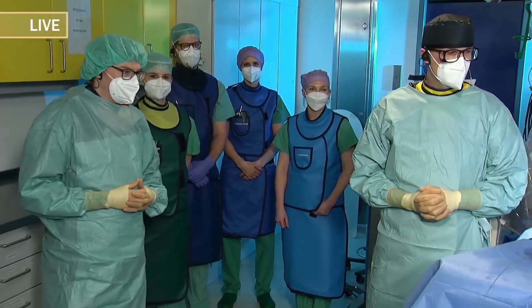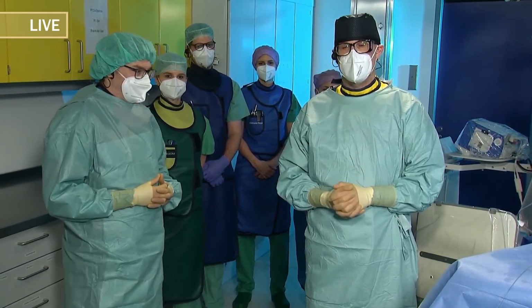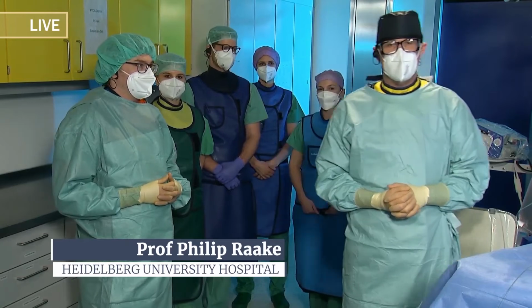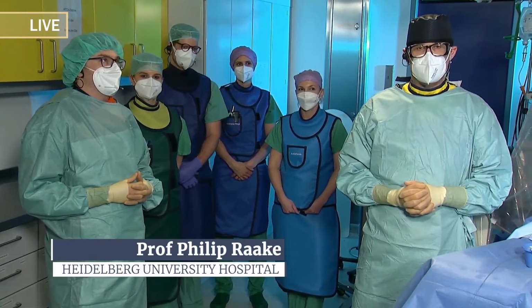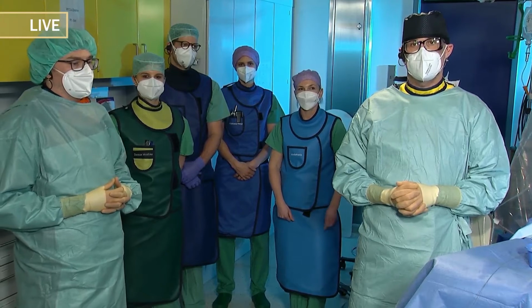Hello, welcome to Heidelberg. Welcome to the University Hospital Heidelberg, to the hybrid OR in our cath lab. We have a live case today for you. It's a PASCAL Ace implant for a patient with tricuspid regurgitation.